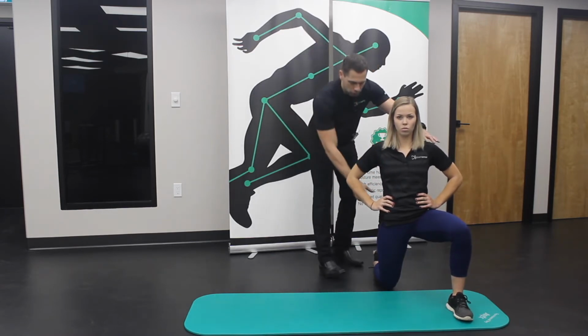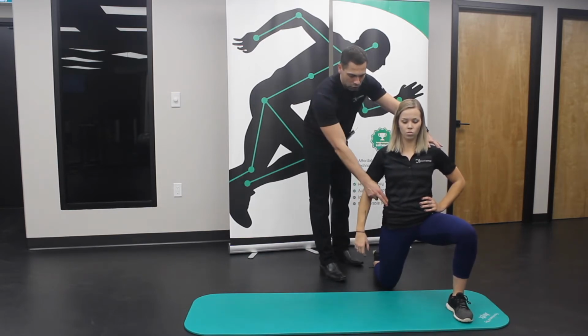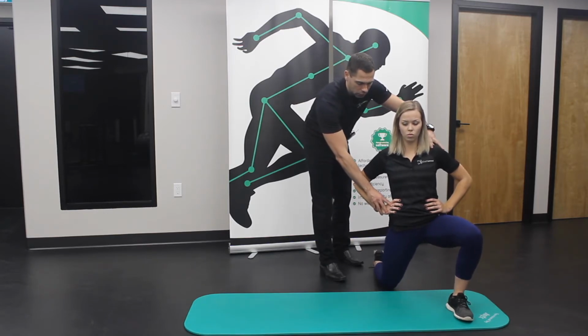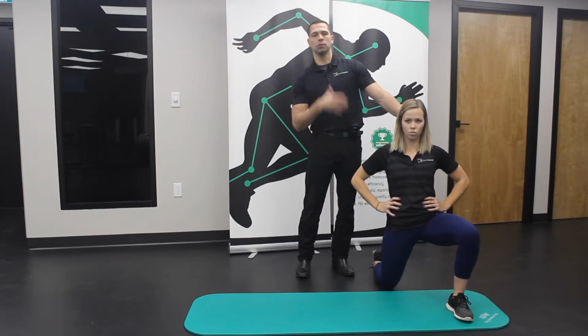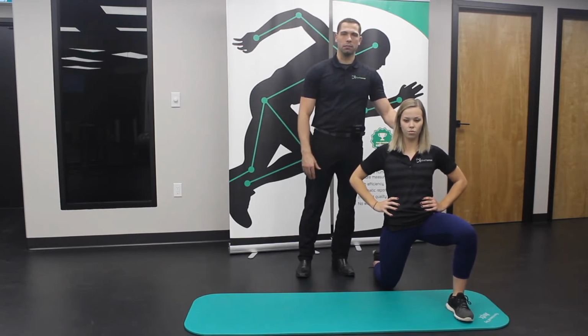We then have Maggie lunge forward, maintaining that pelvic tilt, hand on the hip, and once we get that lockout, we test the lateral shift, trying to drop the body across without leaning the upper torso away. This is simply a glide across with the body.